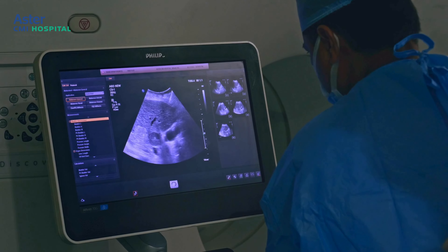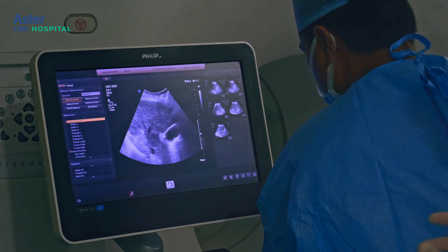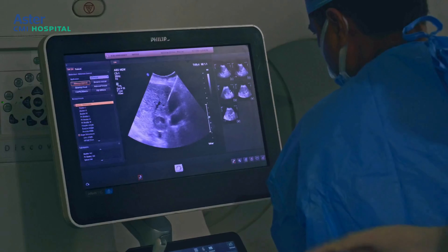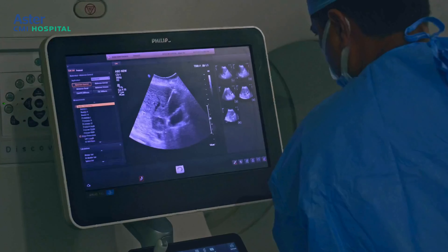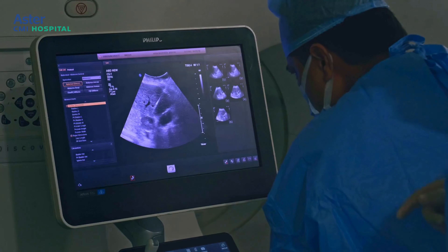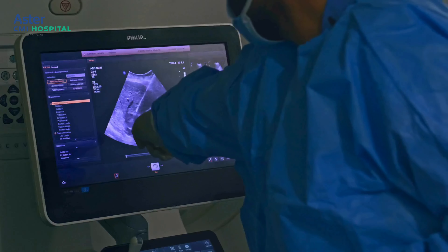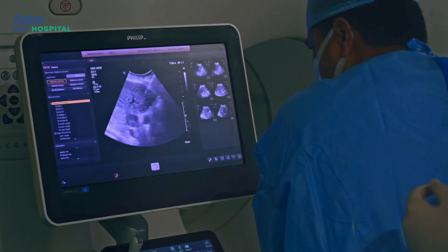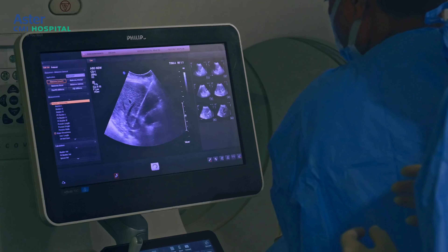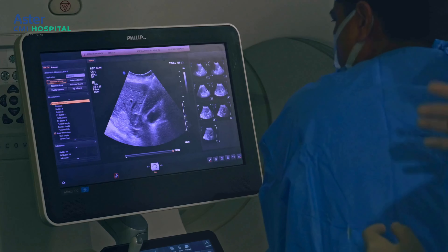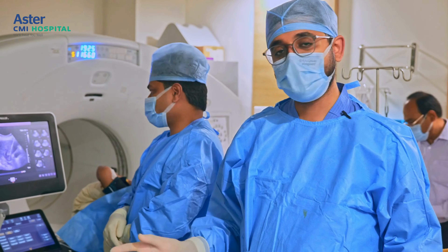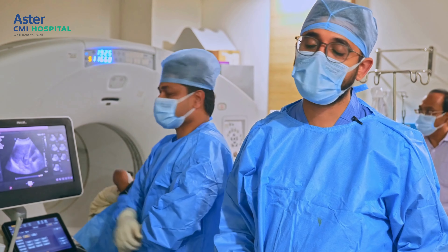We need to be careful not to hit any major artery, portal vein, or hepatic vein branches as we go inside. We are now inside the liver and have entered the capsule. There is a small portal vein branch that Dr. Nishchal is carefully avoiding. We have successfully evaded that, and we are at the capsule of the lesion with the entire needle tract inside and the tip exactly in the center of the lesion — exactly where we wanted to be in the pre-procedural planning. We will take a check CT to confirm needle position before proceeding with ablation.